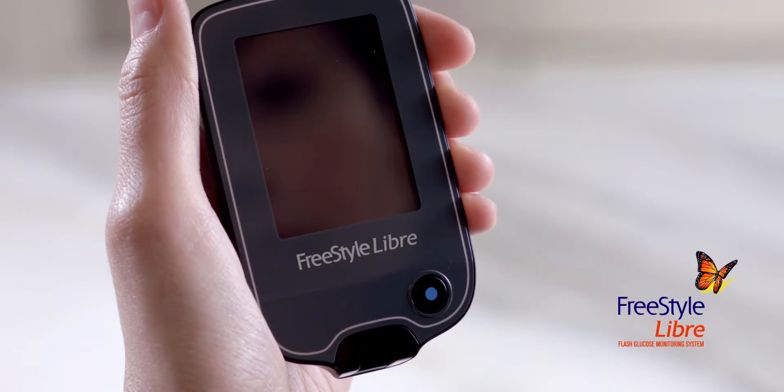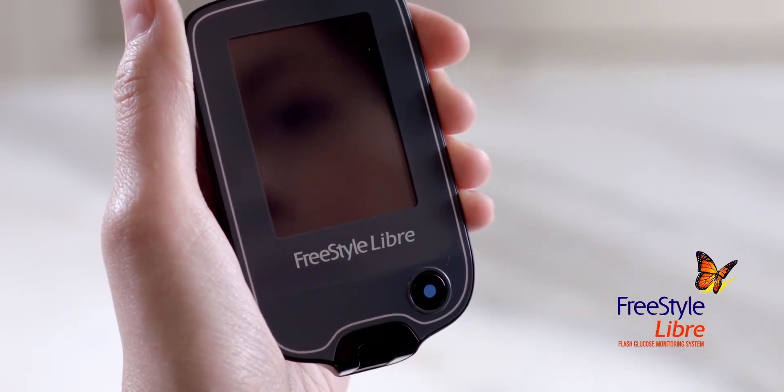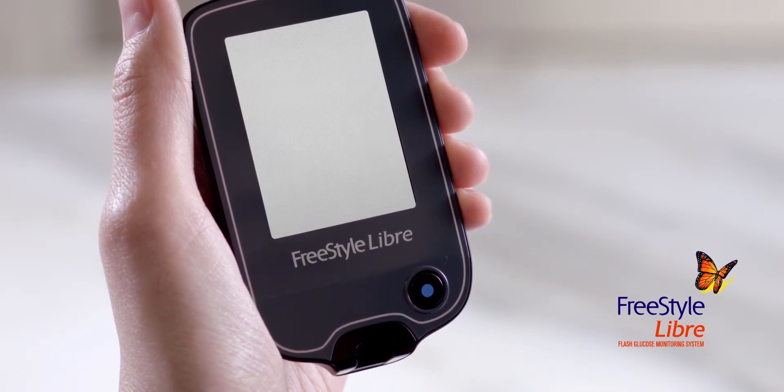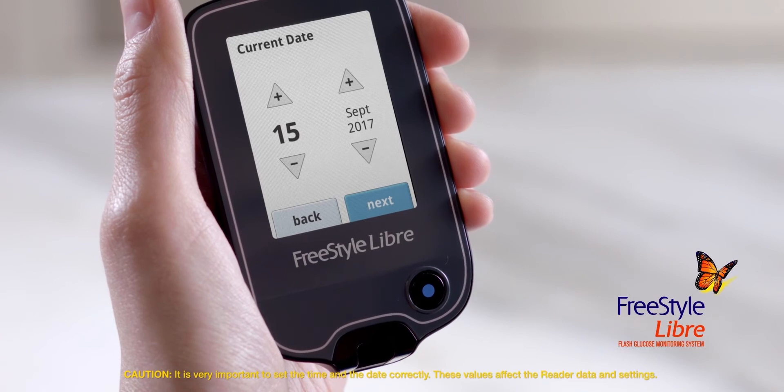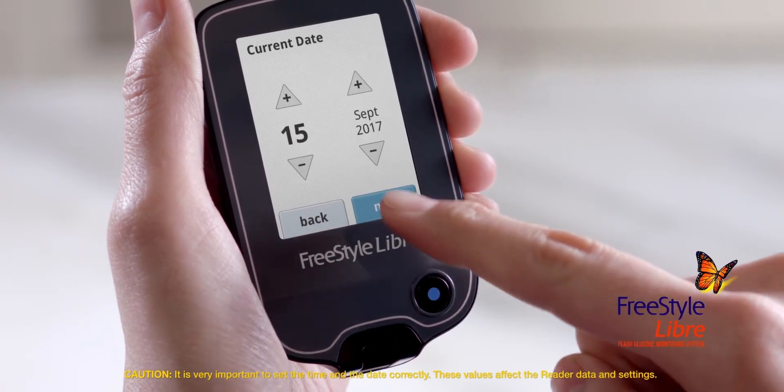First, take the reader out of the box. The unit comes already charged. Then press the blue home button to turn on your reader — it's the only button. All other actions are done on the touch screen. You can set the current date using the arrows on the touch screen. Tap Next to continue.